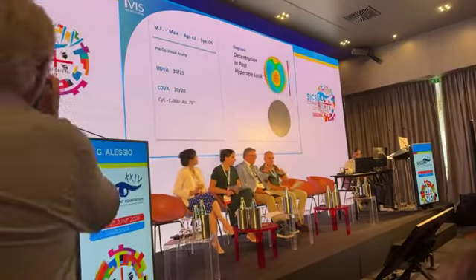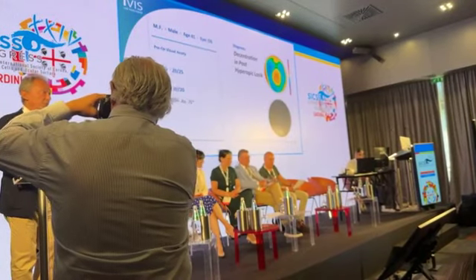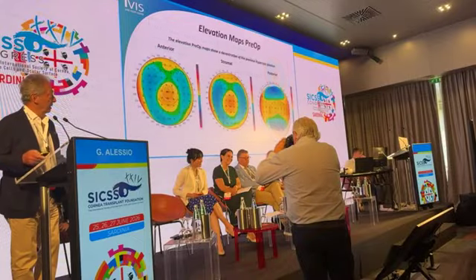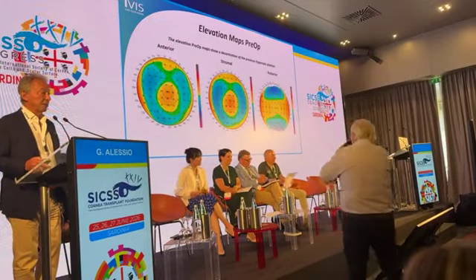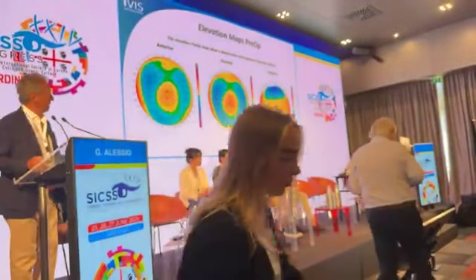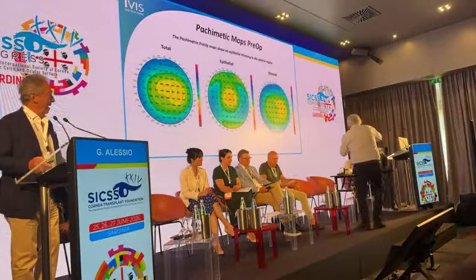This is the patient who had hyperopic LASIK and is not happy with the results. Looking at the topography, I think he looked up during the surgery, so the result is a decentered apex on the cornea. This is the posterior surface, which shows us that there is no ectasia, because the anterior surface looks like an ectasia.